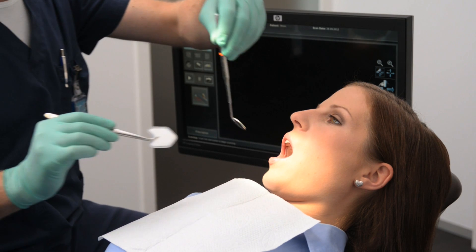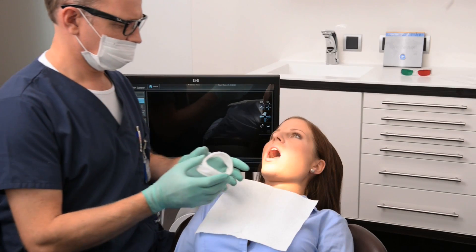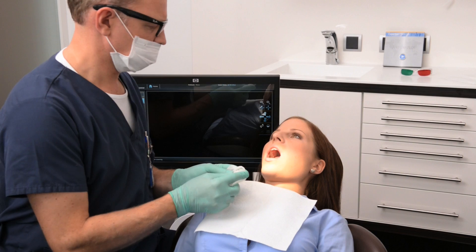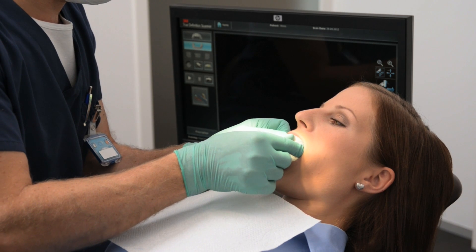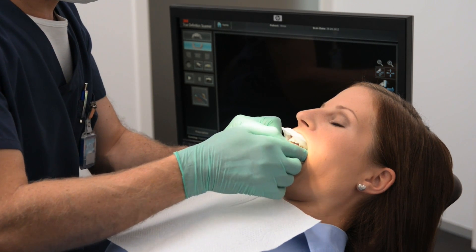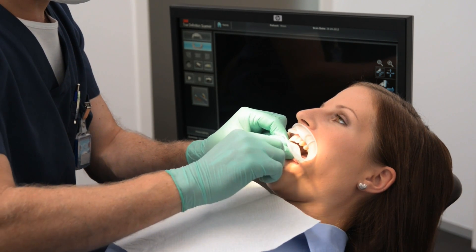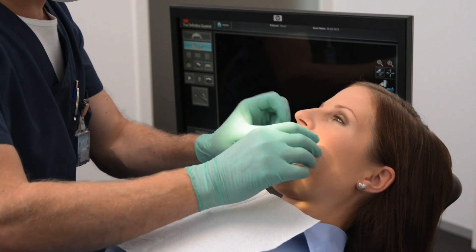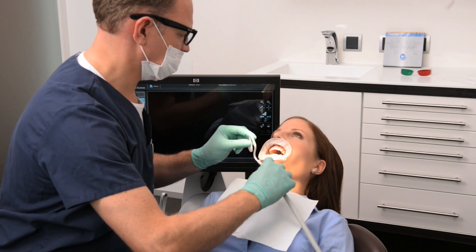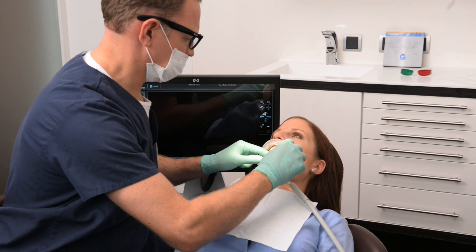Isolation. Good moisture control is essential on the lower arch, and for this case we will demonstrate some techniques that our trainers recommend. We'll start by inserting two dry tips into the cheek before inserting the Optragate from Ivoclar. Slide both sides simultaneously into the mouth and let the upper and lower rims rest against the teeth before securing the rim in the lip sulcus. Detailed instructions are available on the product wrapping. Hygiformic saliva ejectors work well in isolating the tongue and maintaining a dry field.